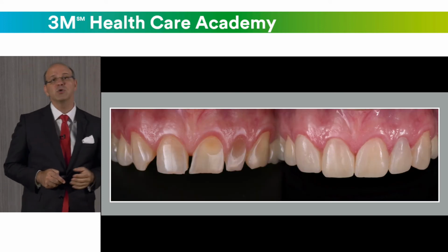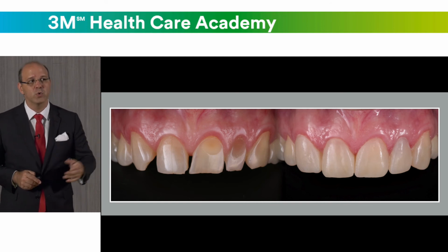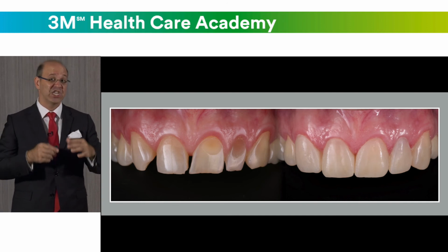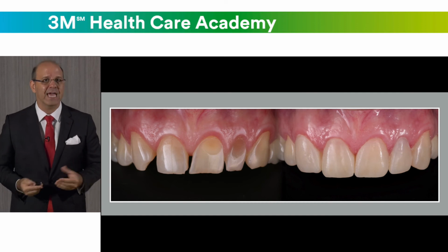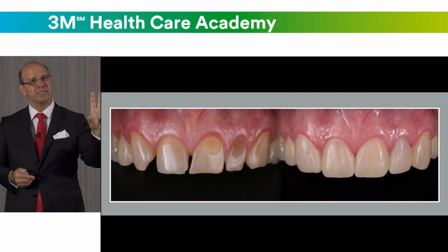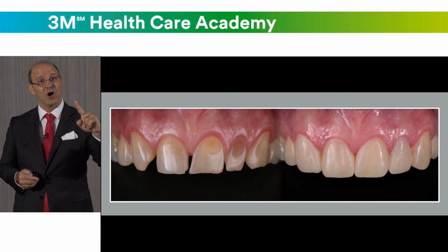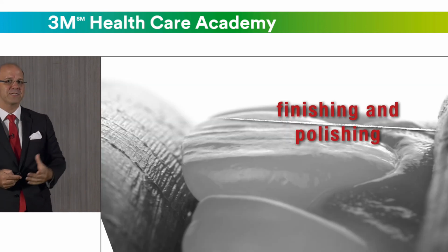So it's another solution for cases where we want a more predictable shape in the end, compared with a direct application of composite resin. It's like you just invert the layering technique: you apply the composite from the buccal to the palatal, on the other side from where you usually apply the normal layering technique with a direct composite resin.